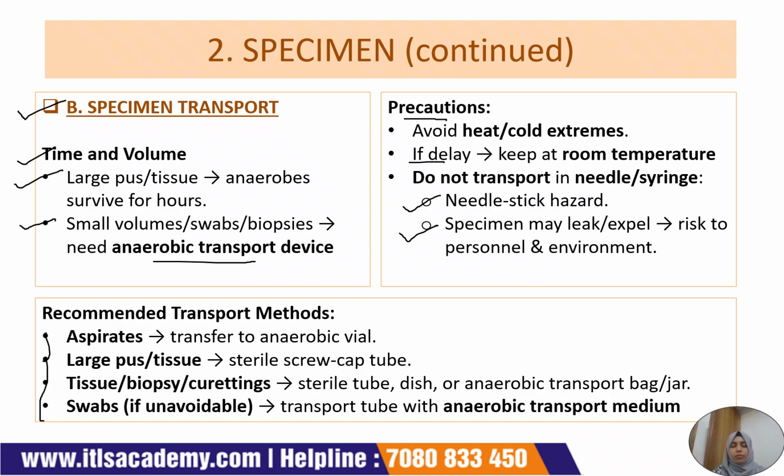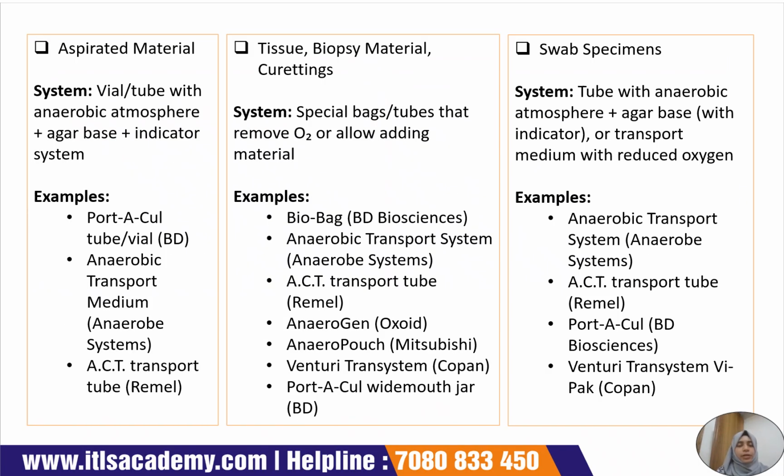But if their use is unavoidable, the specimen must be transported via a transport tube with anaerobic transport medium. Now in this particular slide, we will discuss the anaerobic transportation systems. Here we have mentioned the specimens, the transportation systems, and the available commercial systems.